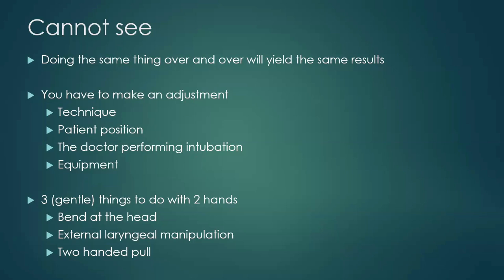External laryngeal manipulation. So important. One hand again on the laryngoscope, and your other hand is going to be gently manipulating the larynx itself to hopefully get a better view. Once you have the best view that you can obtain, you're going to ask someone else to put their hand there and hold it in place. Don't ask someone else to move the larynx for you, because they cannot see what you can see. Their left and right and up and down is going to look in their minds a lot different to what you can physically see, and you're just going to be delaying the effectiveness of this.